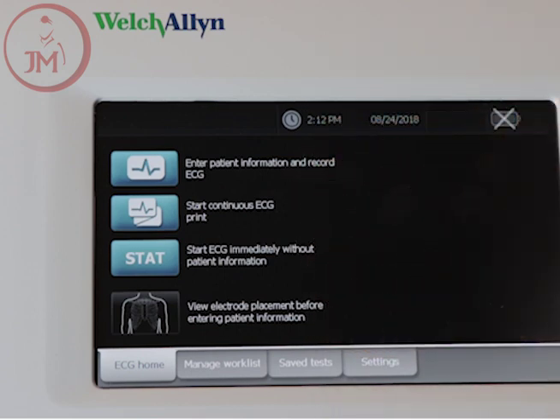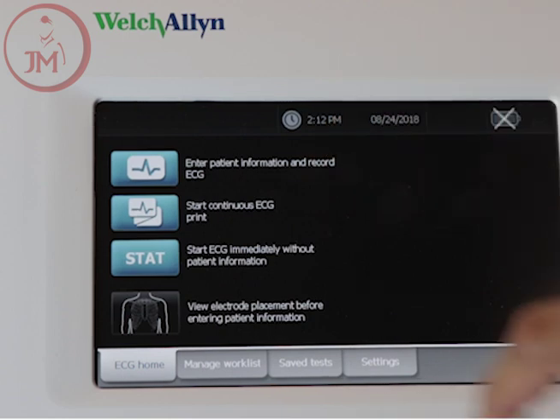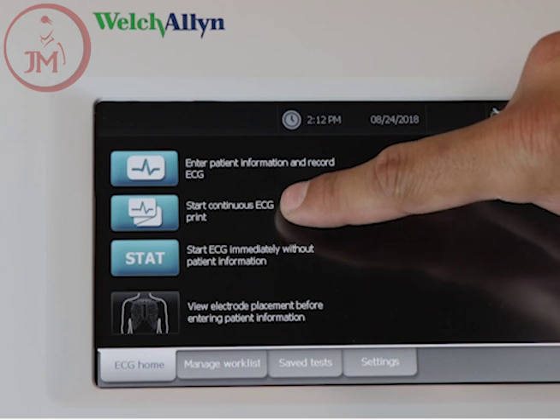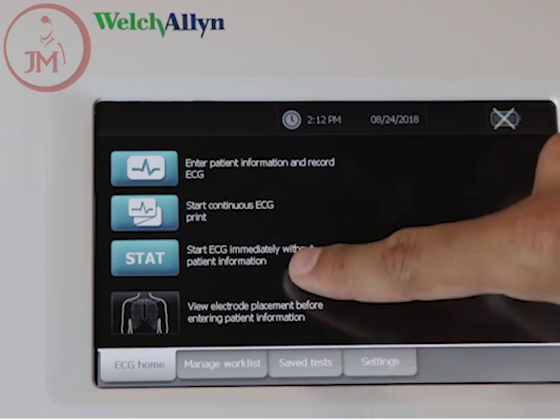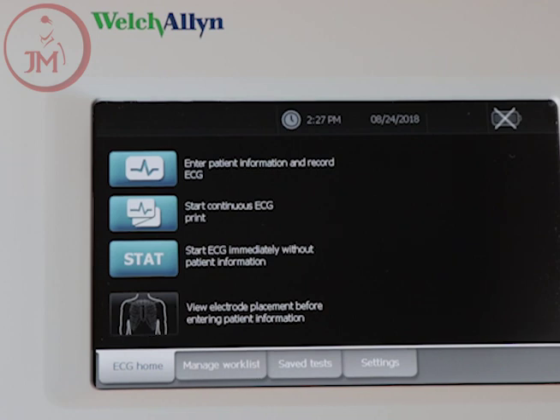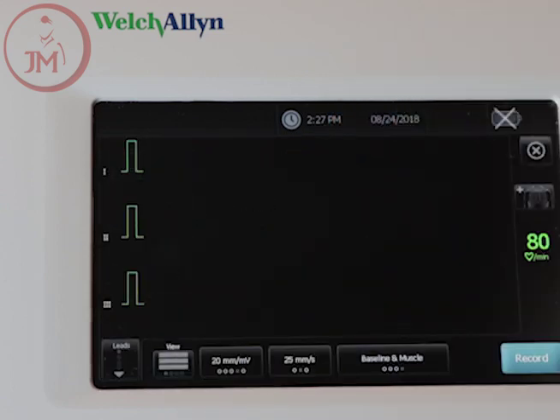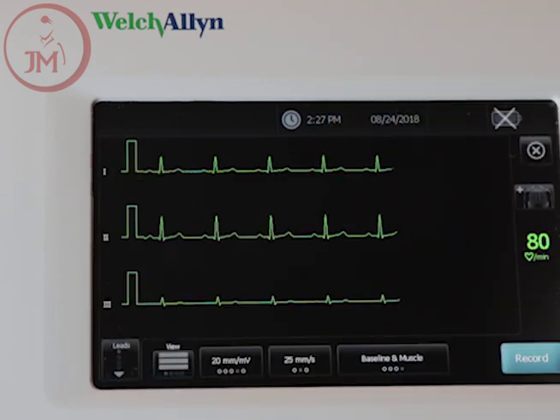From the main screen you have three options to choose from: you can take a standard 12-lead ECG while entering patient information, you can take a rhythm strip, or a stat ECG. We're going to go ahead and go to stat ECG.